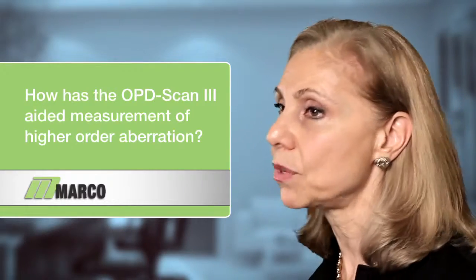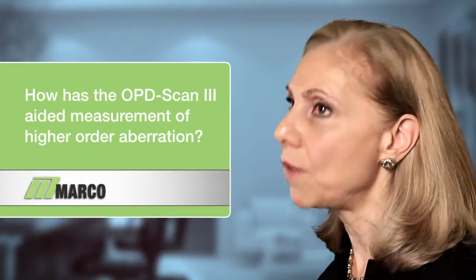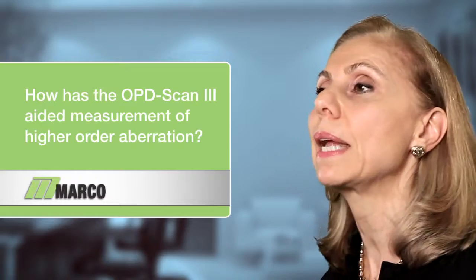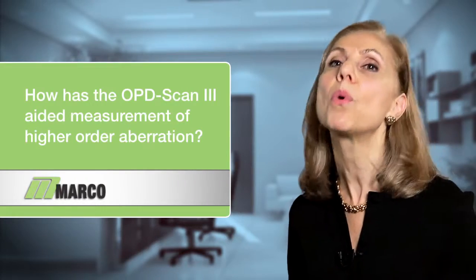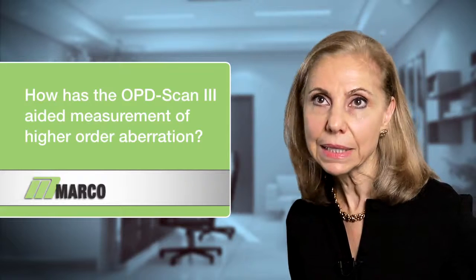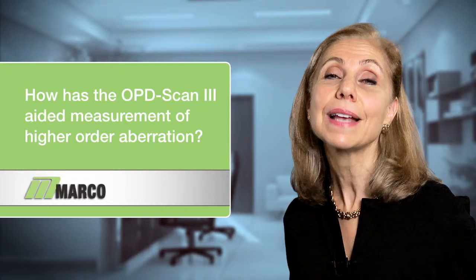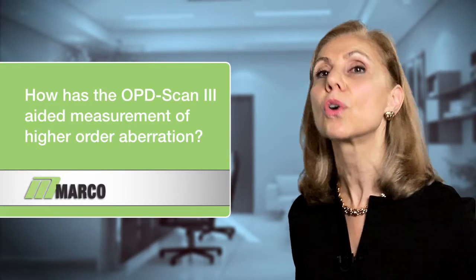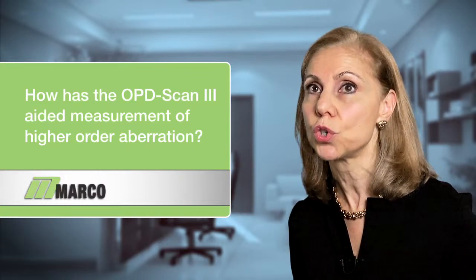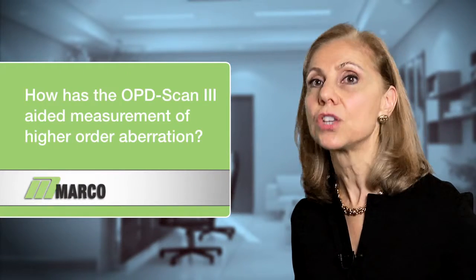they now know that even after cataract surgery, they can expect a little bit of feathering or glare or halos, however one wants to explain it, towards a point source of light. So as a result, I don't get complaints anymore from patients saying, I didn't realize I would still have a little bit of glare or a little bit of feathering from oncoming headlights or when I look at a street lamp. It's all discussed ahead of time. The expectations are set.